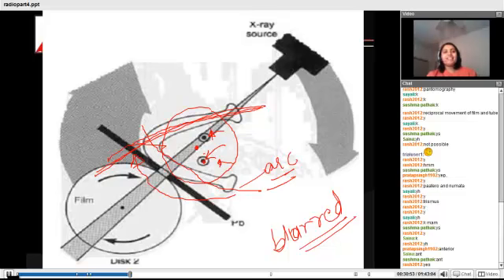Yeah, so basically what is happening is that when we are reaching here, there is a shift in the center of rotation, and we actually targeted this particular portion, but this portion was not taken care of because the center of rotation was not related to it. Now imagine a scenario if I put 3 centers of rotation. Okay, when the X-ray is sweeping, let me just clear the mess. I usually mess up my whiteboard.